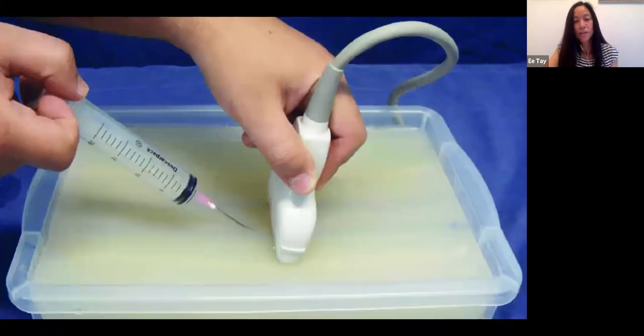Okay. So these are reusable, and they do also leave tracks too, but it is a cheaper way of doing it. It is just time consuming that you have to make it. It doesn't last very long. After a few days, it starts to mold if you don't take good care of it. So it becomes a little nasty after a while, but it is one way for you to make a phantom.